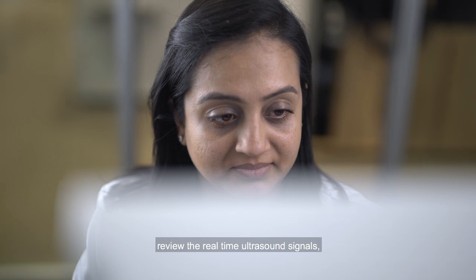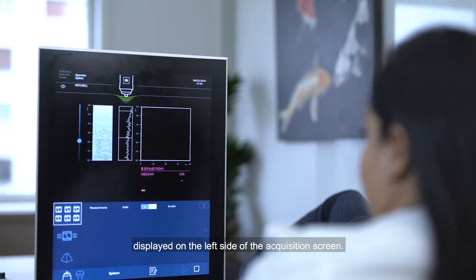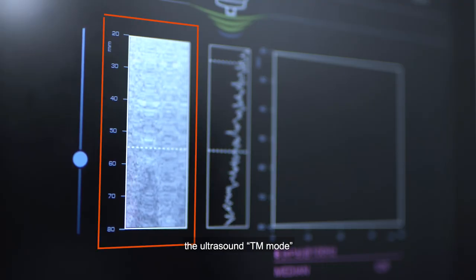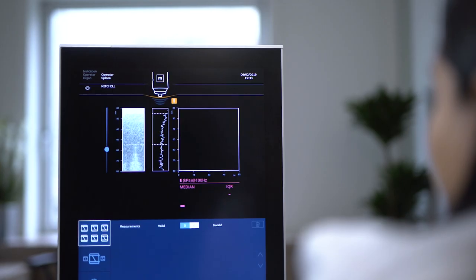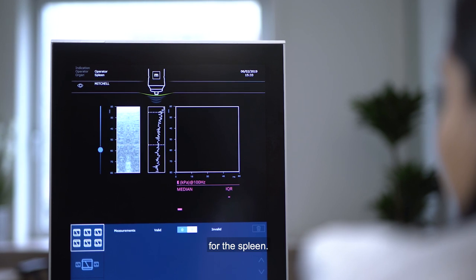To adjust probe position, review the real-time ultrasound signals, also known as TM mode, displayed on the left side of the acquisition screen. As it is for a liver examination, the ultrasound TM mode on the left must be uniformly layered and the decrease of the A mode on the right must remain linear, which together corresponds to the typical acoustic signals for the spleen.